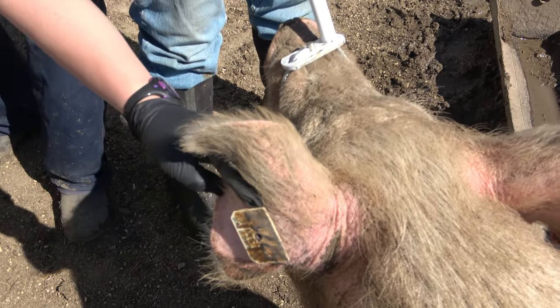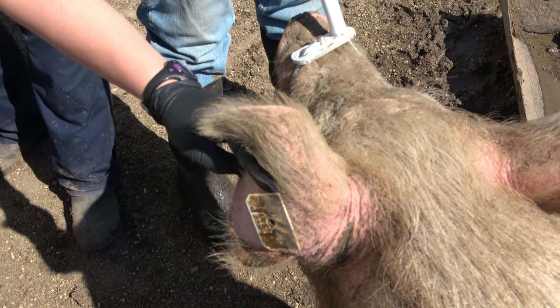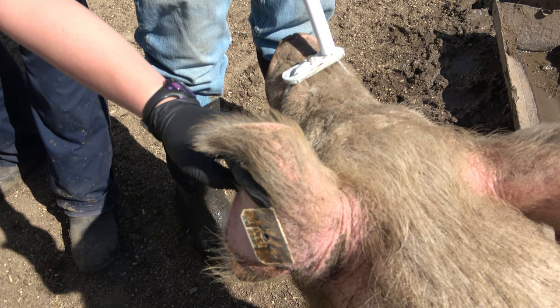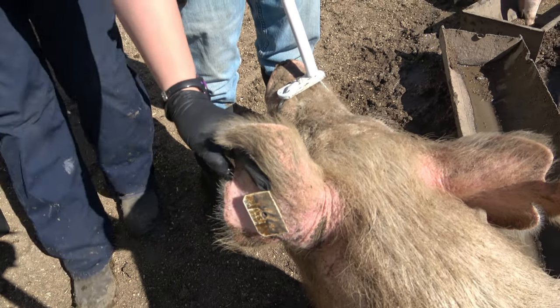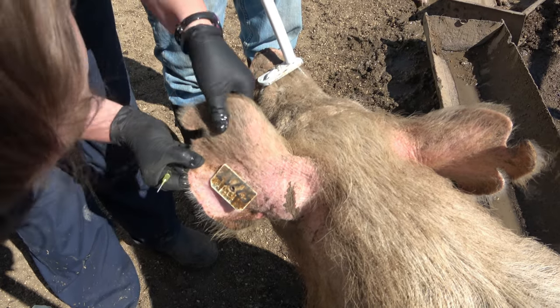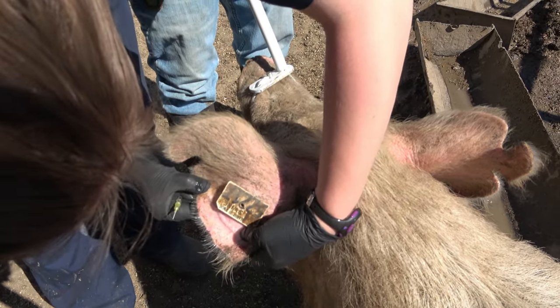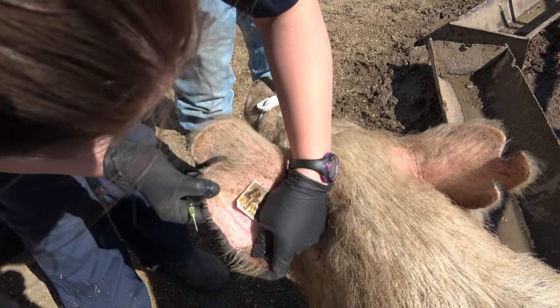And you do want to make sure that you're already prepared with all of your stuff out and ready. I have my little workspace right here that's all ready to go with my tape, my catheter, and my cap. If you have questions about how to insert a catheter, do see my catheter insertion video that I also have on YouTube. We're just going to go ahead and go with this since this pig is awake.